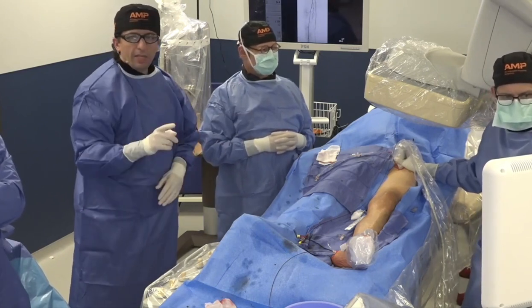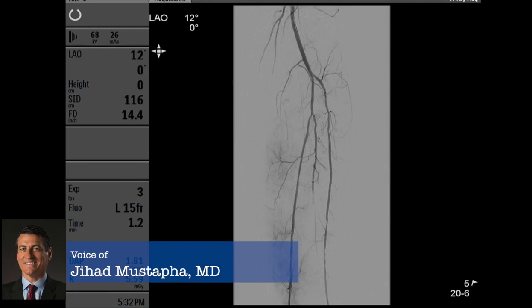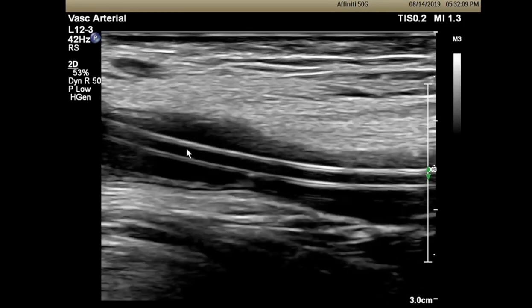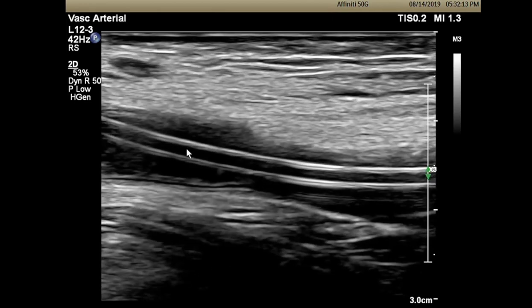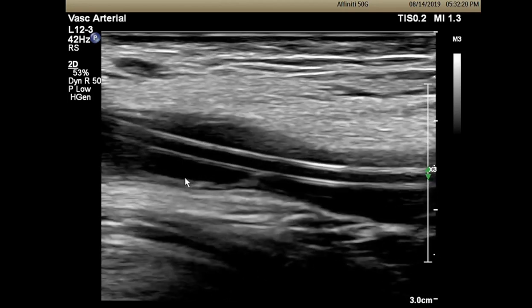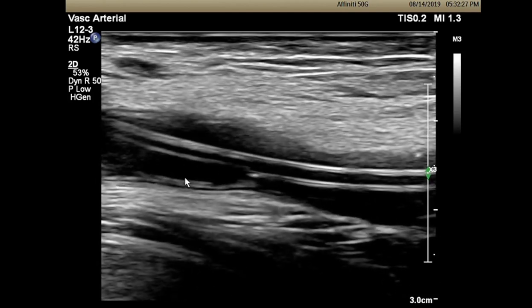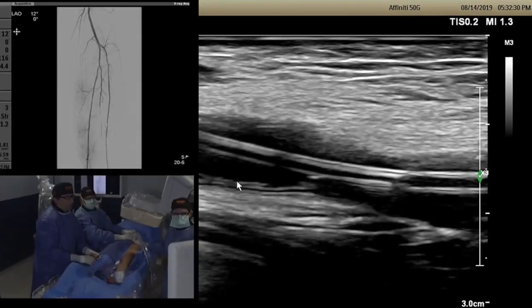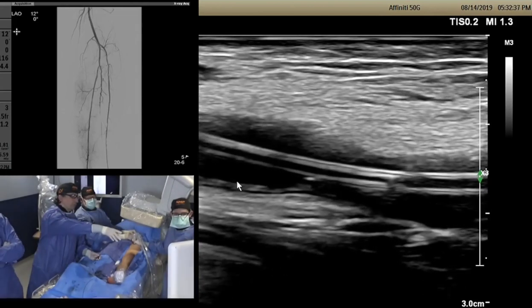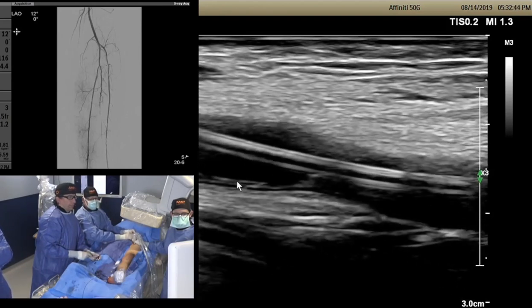Can you show the extravascular ultrasound please? This is the integrated access — what you see at seven o'clock is the femoral head. This is a four French sheath. We're going to advance the Navicross under ultrasound guidance. What you see is the Navicross inside the sheath. Remember, this is a flush occlusion — our sheath is in the profunda. Go ahead and pull the sheath over the Navicross slowly.